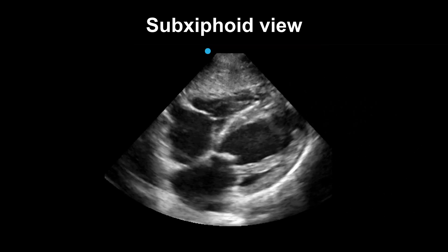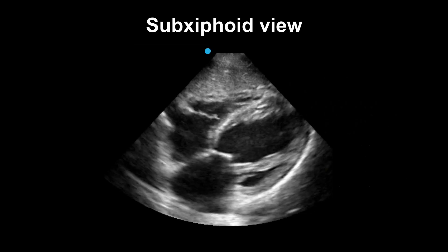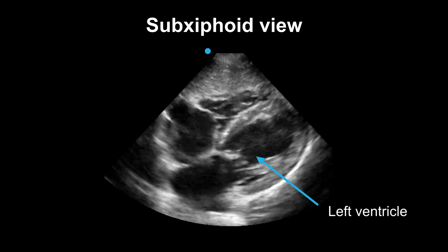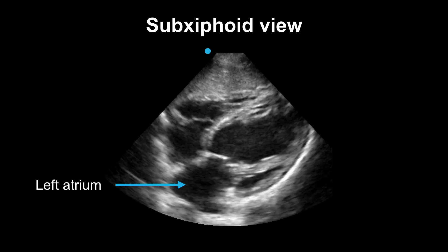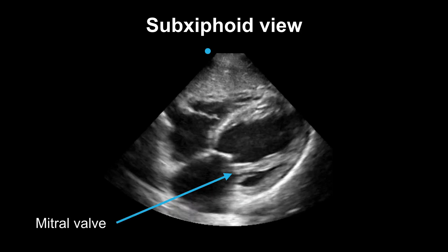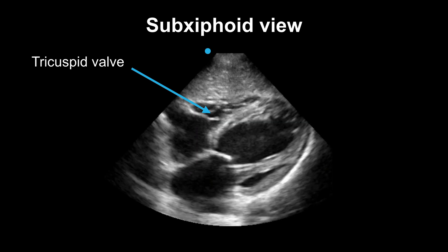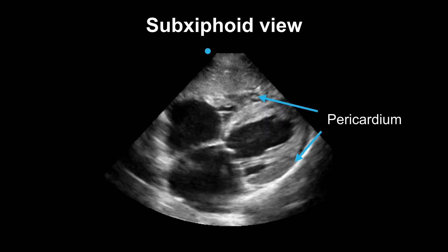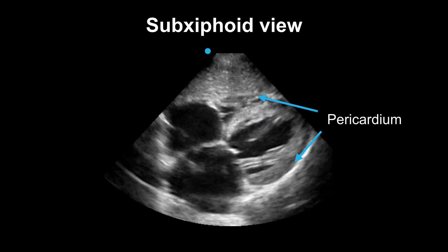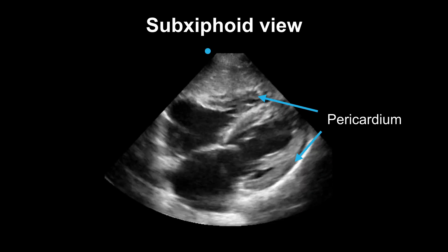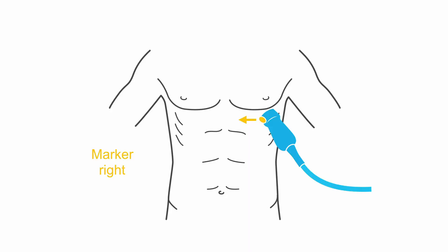Again to orient: the right and left ventricles, the right atrium, left atrium, your mitral valve, and your tricuspid valve. Don't forget that your bright white hyperechoic line will surround your heart — that will be your pericardium.